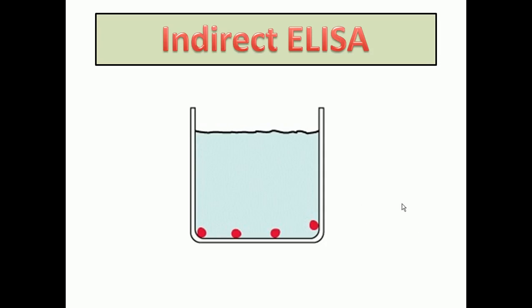Now this is completely manufactured by the laboratories and companies. You can see here these red things, though they are few, but actually in the wells there are many more in reality. Those antigens are coated, and they are very specific to adhere to a particular type of antibody, right? Now let's say upon a particular infection in our body, we develop certain antibodies.